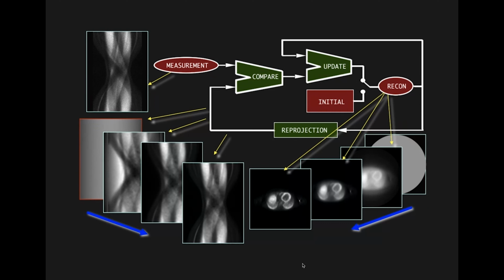I have also a question. Yes, go ahead. How much time can it take to reconstruct using this technique? Well, that's the tricky part in some ways. If you would do that with your PC and you would have a full CT scan, it might take several hours to do the reconstruction.